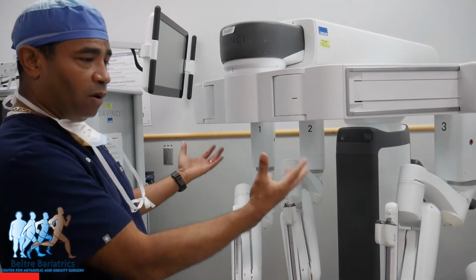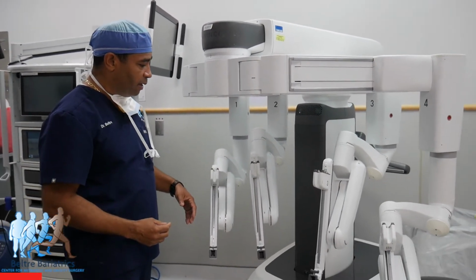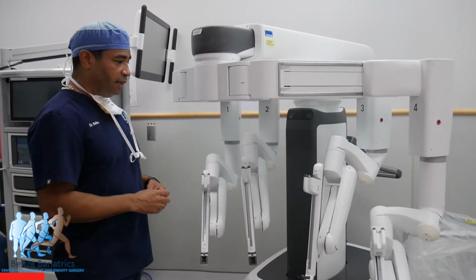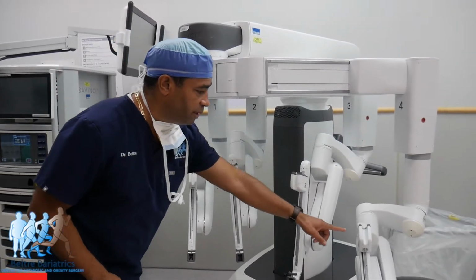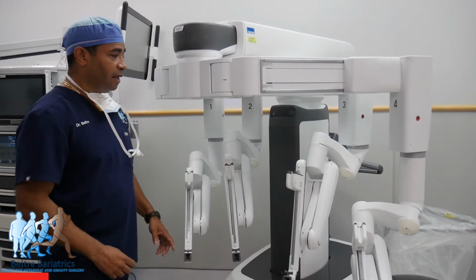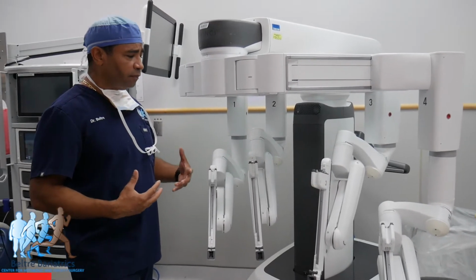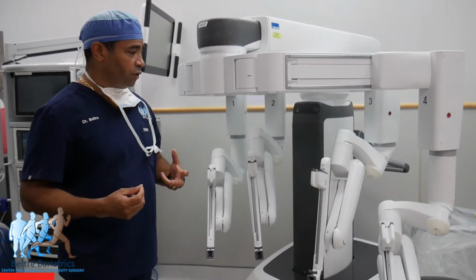So we bring this robot over the patient and then we dock it, meaning that the robotic arms get attached to these ports that are sitting in the patient. Like I said, the instruments go in this instrument bay, and then when we introduce the instruments into the patient, I will come out and sit by the surgeon's console to begin the procedure.